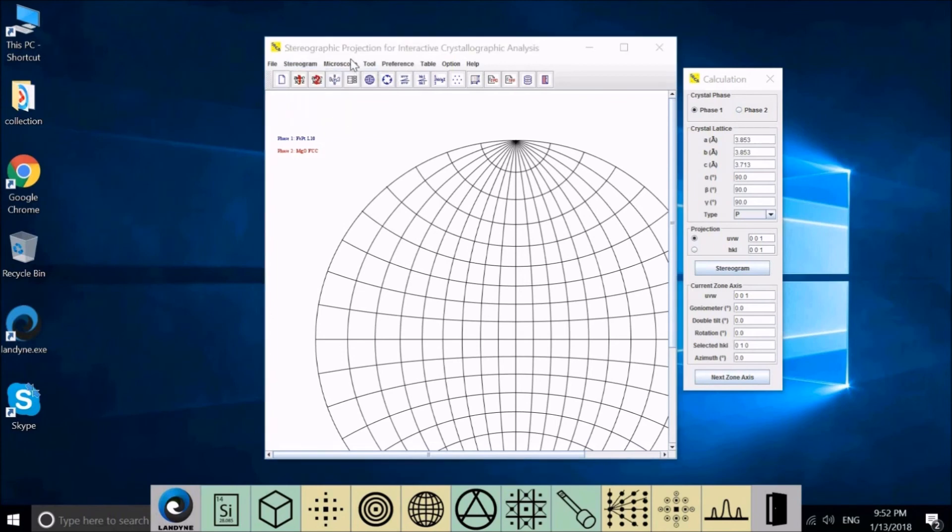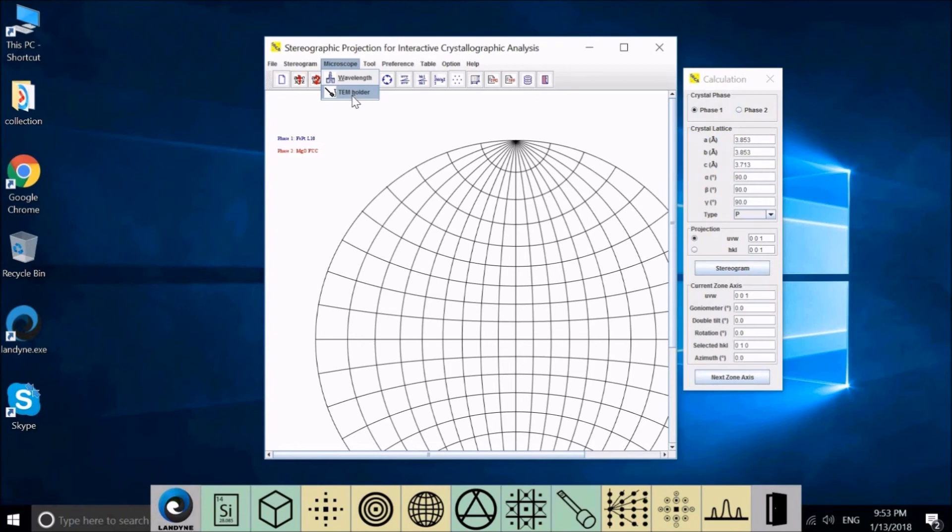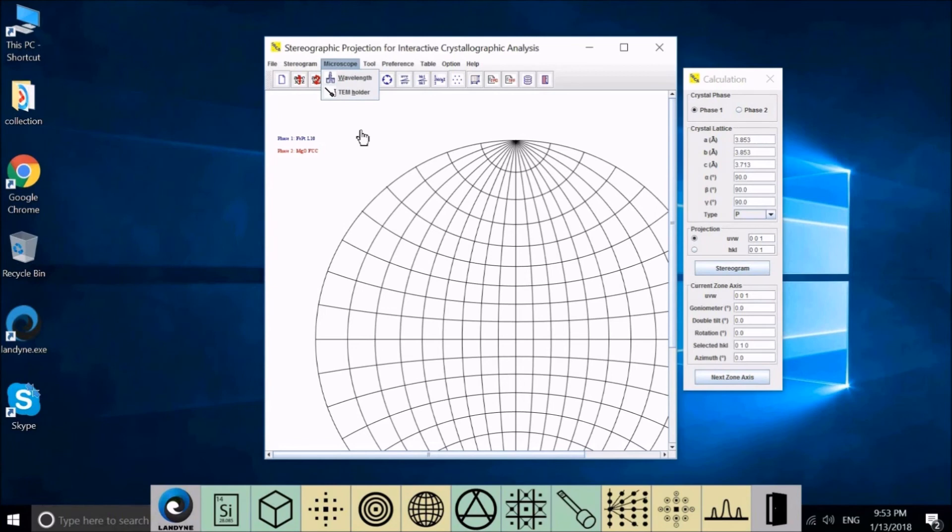In Microscope, two parameters you can change: the high tension, therefore the wavelength, and the distance for the TEM holder, double tilt or rotation. These two parameters are not for the generation of the stereogram, but for other applications. We'll explain this later.